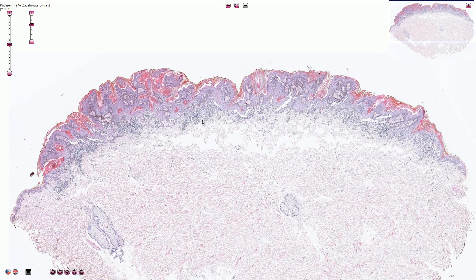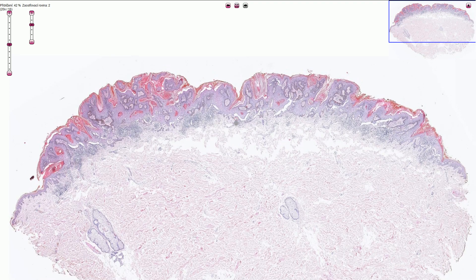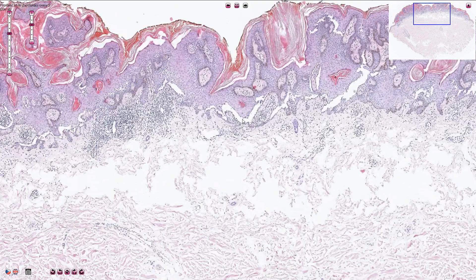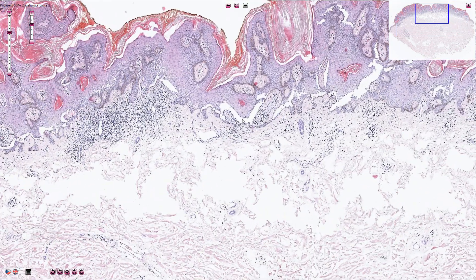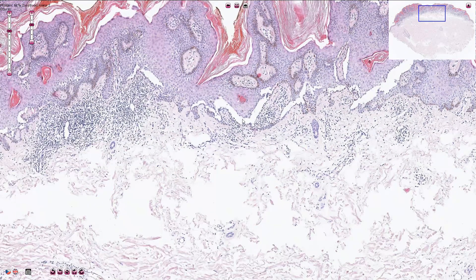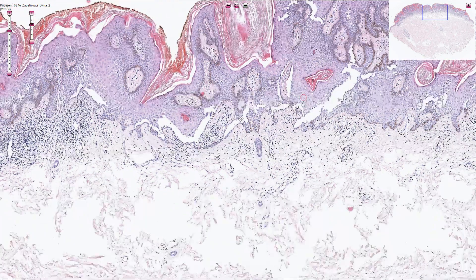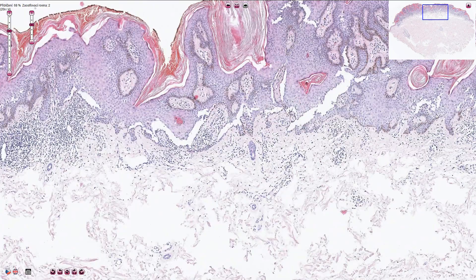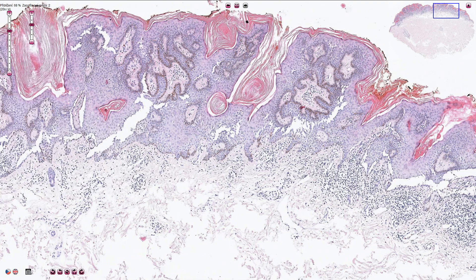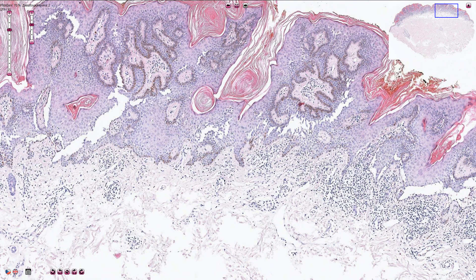Some cases of seborrheic keratosis can be associated with prominent acantholysis. Acantholysis is the loss of intercellular connections or desmosomes, resulting in loss of cohesion between keratinocytes. We can see these clear spaces throughout the tumor, representing loss of desmosomes and loss of cohesion of the keratinocytes.